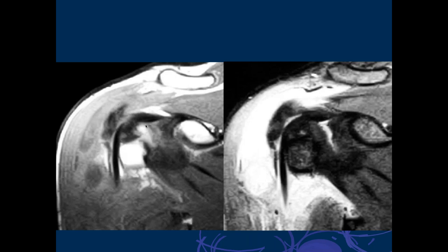There's a large subacromial subdeltoid effusion. It's kind of heterogeneous. I think there's involvement of the supraspinatus, and possibly the bone, possibly the humeral head is involved also. He didn't go to the hospital at this point. He's still an outpatient, and they got this scan. Yeah, we don't have good images of the bone here.